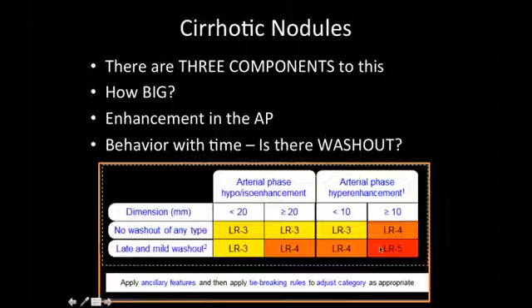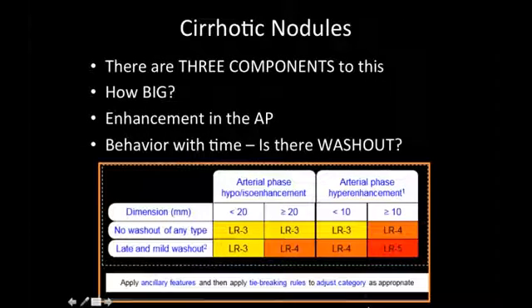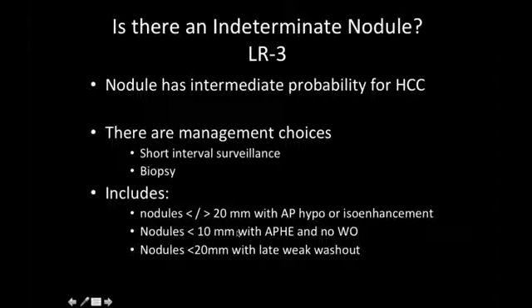So here's a patient with ethanol cirrhosis with a 2-centimeter nodule detected on a surveillance ultrasound scan. So when we inject the contrast, we can see nice vascularity in the liver, and we can show totally homogeneous enhancement of the liver and no differentiation between the enhancement of the nodule with the adjacent parenchyma. So this is isovascular in the arterial phase. So if we look at where our nodule is, we can see that there is no variation in the enhancement.